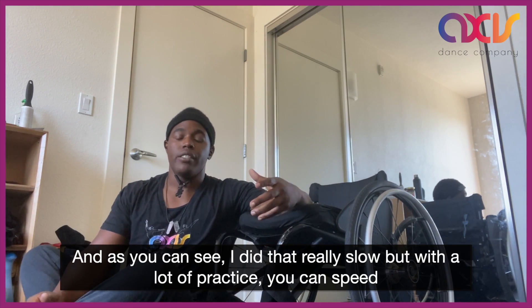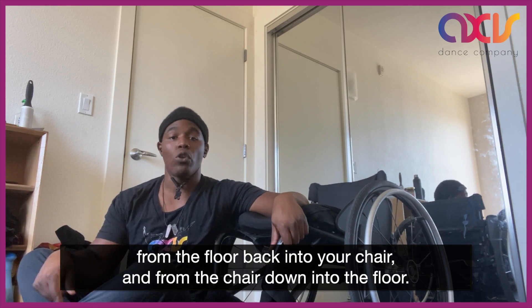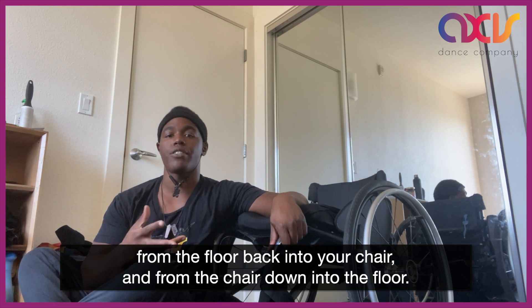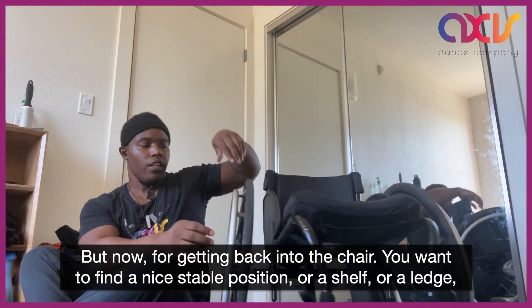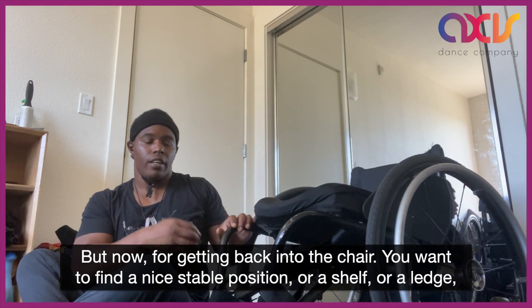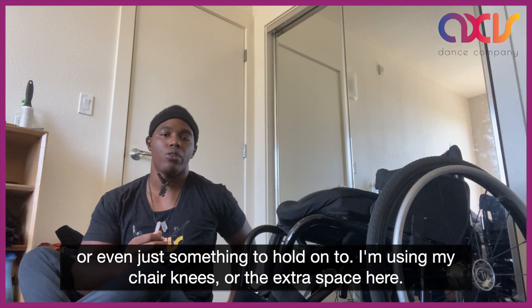As you can see I did it really slow, but with a lot of practice you can speed from the floor back into your chair and from the chair down onto the floor. But now for getting back into the chair, you want to find a nice stable position or a shelf or a ledge or even just something to hold on to.